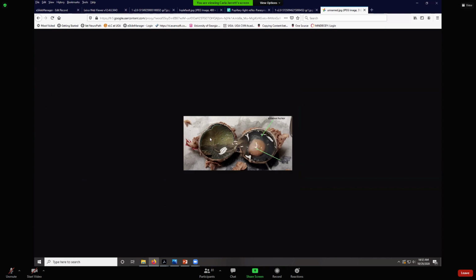And it keeps this white wrinkled membrane right here. That's the visual retina. And you can see the pretty colored tapetum up underneath it. This is the non-tapetal area, and this is the tapetal area. This vitreous body, which is kept hydrated with vitreous humor, it keeps that retina from detaching.